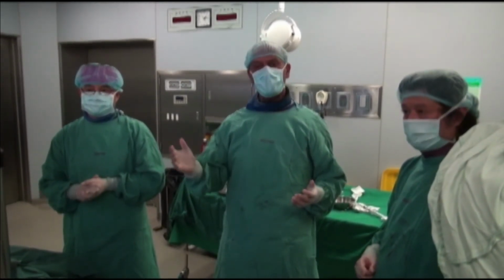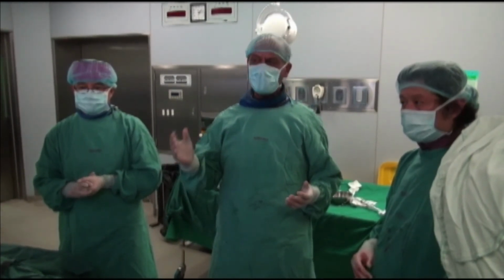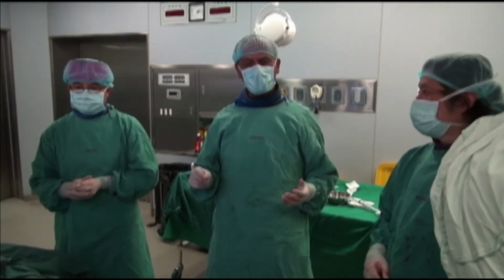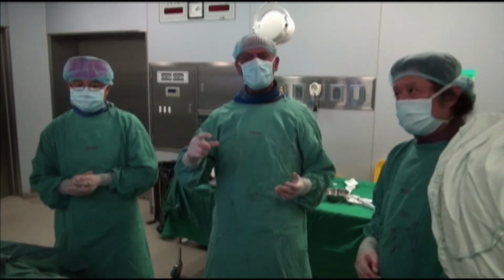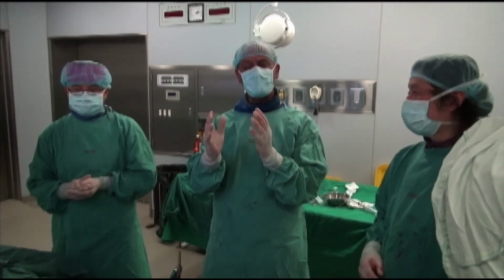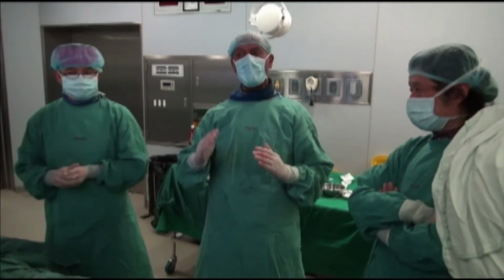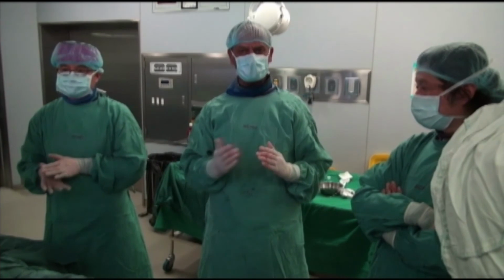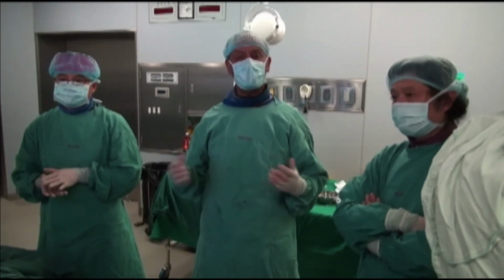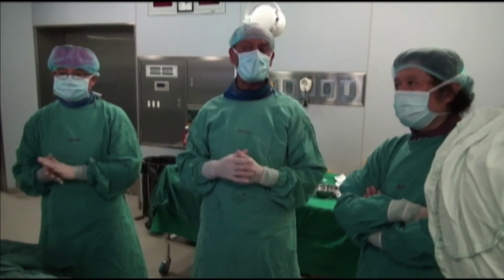The repair had a significant pulmonary insufficiency because he had a transannular patch. When we did the angiogram, there was severe pulmonary insufficiency. You saw the angiogram, and then we placed a 30 millimeter diameter Venus P valve, and the straight segment was 2.5 centimeters. Of course, the distal part of the valve, about 10 millimeters, is uncovered. The straight segment and the proximal part are covered by porcine pericardium. And the final angiogram showed that there was no pulmonary insufficiency at all, and the PA pressure was as high as the RV pressure, so there was no gradient at all.